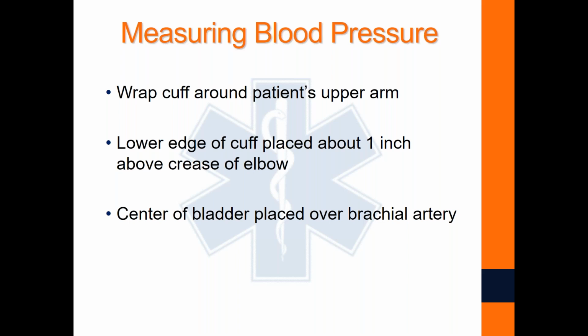And then we're going to still slowly let that blood pressure cuff deflate and deflate, and those Korotkoff sounds will get louder. And then they'll start getting softer and softer until they eventually go away as well. Whatever number is on the dial, when we see those blood pressure sounds go away and those Korotkoff sounds stop, that's their diastolic number. That's that bottom number we're looking for.